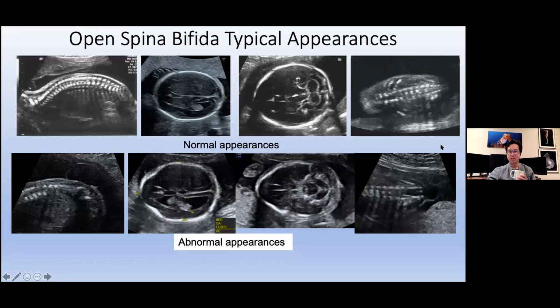Okay, here's another example in coronal plane of the fetal spine, complete all the way down. Here, there's a defect right at the bottom. There's a little cystic structure. So all of these are the constellation of findings that you would expect with an open neural tube defect or open spina bifida. This is the normal. So look at how these differences all combine. And so when you see a normal skull shape and cerebellum and posterior fossa, the likelihood that you have an open neural tube defect decreases.